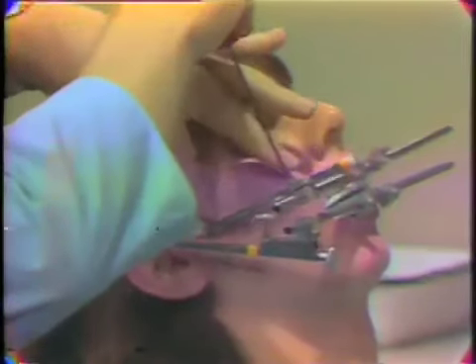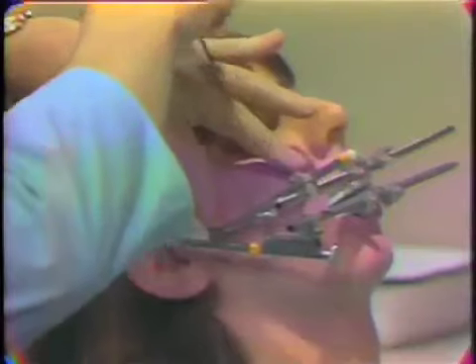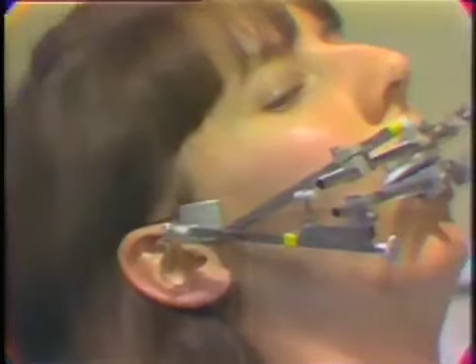To aid us in locating the hinge axis, we will put a surface between the skin and the stylus to give us a contrasting surface. This surface consists of a series of dots which helps us to locate this rotation position fairly rapidly.